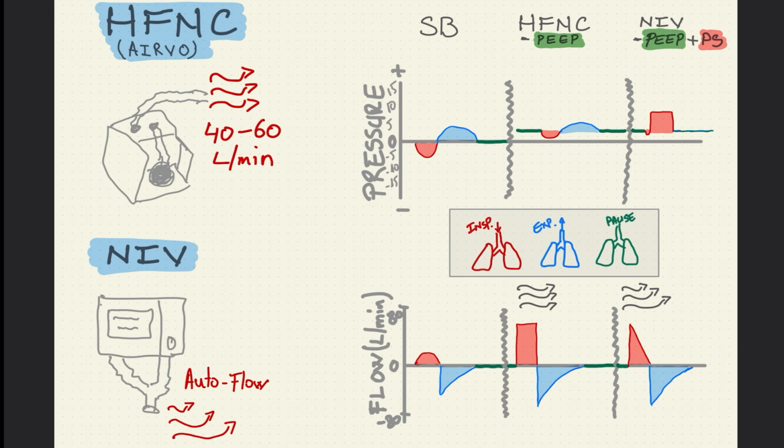Again, the patient is spontaneously breathing, and notice as the diaphragm contracts, the pressure starts dropping inside the thoracic cavity. Because the pressure started from a positive value of 5, and because even during inspiration the airflow is being maintained constantly, the pressure does not drop below 0, or maybe does not even reach values of 0.